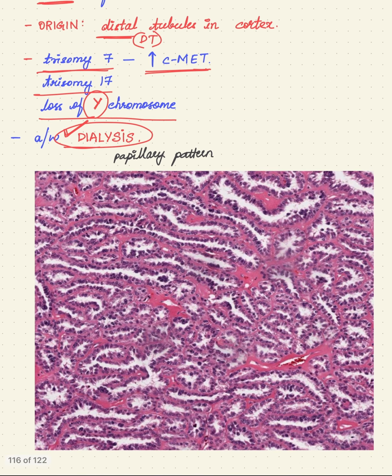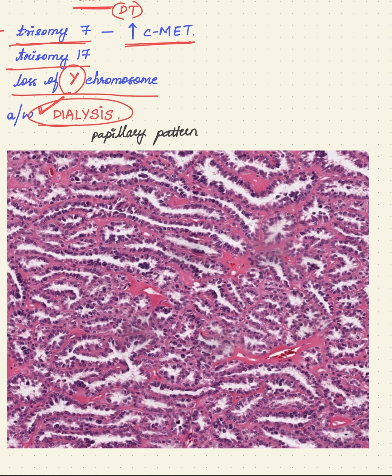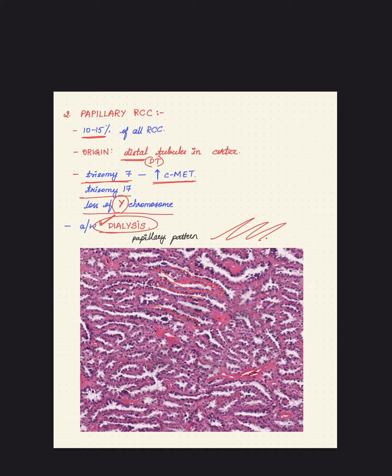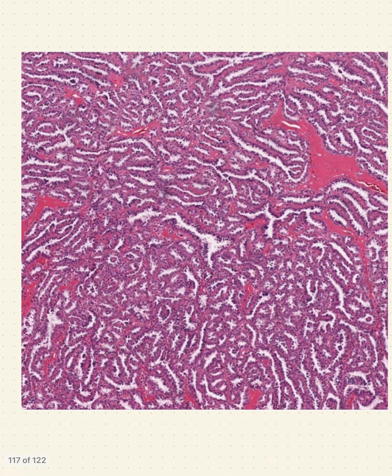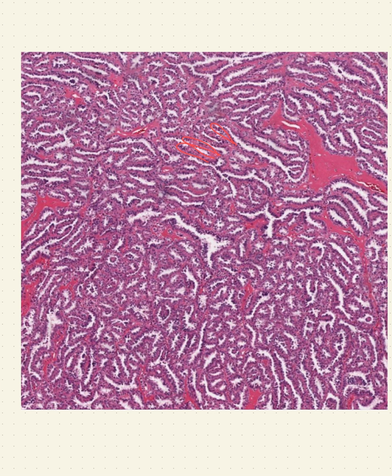This papillary microscopic slide shows you the tumor cells in the papillary variant. Papillae are nothing but long finger-like projections. Here, in the tumor cells you can identify extreme, thin branching. This is the papillary architecture. When you zoom in, see these long finger-like projections with extreme, thin, delicate branching. This is the papillary architecture.